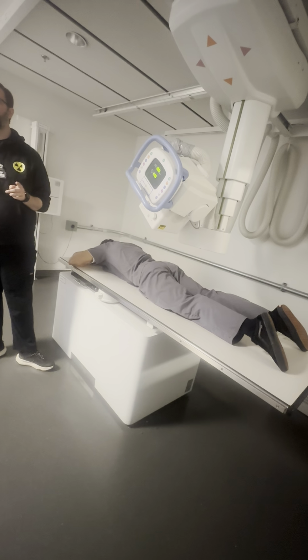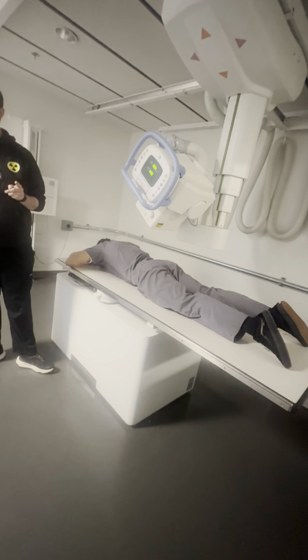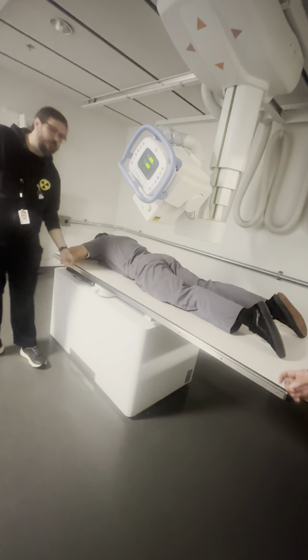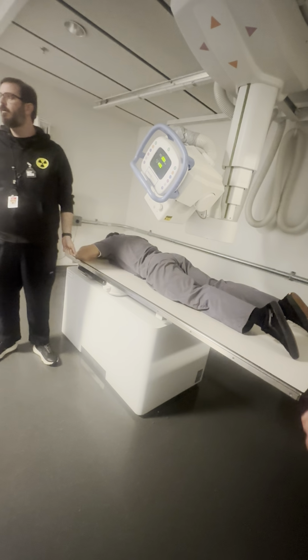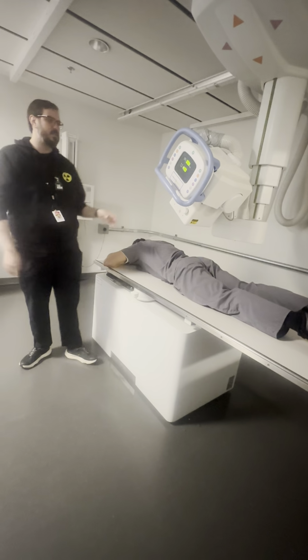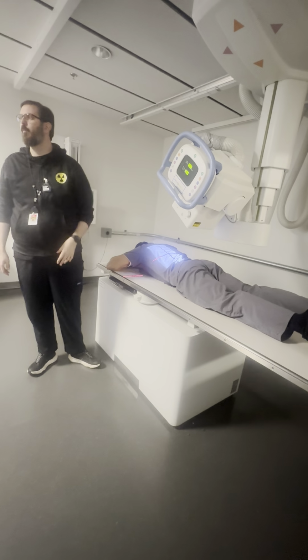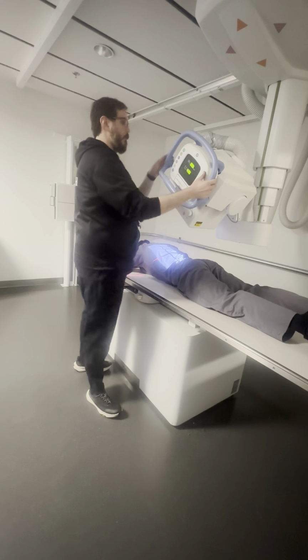Why do you guys think? They forgot to detent it to the angle. They weren't moving their board after, right? So make sure you're re-detenting every single time, because they were doing close enough to the angle, but they weren't detenting the back. You can lay on your back for me now.